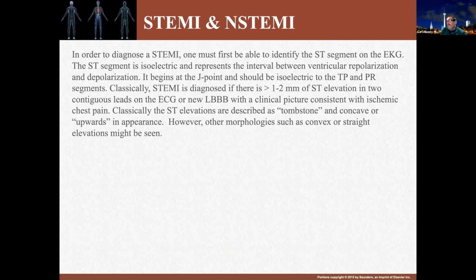The ST segment is isoelectric, and it represents the interval between ventricular repolarization and depolarization, beginning at the J point. And the ST segment should normally be isoelectric to the TP and PR segments as well. In other words, along the straight line, which is the isoelectric line.